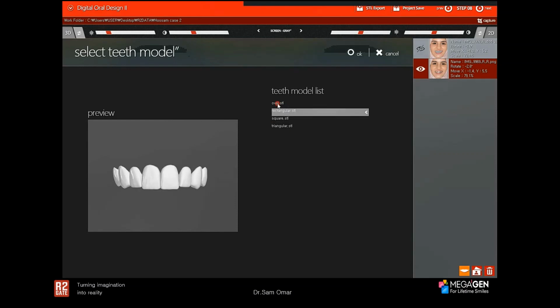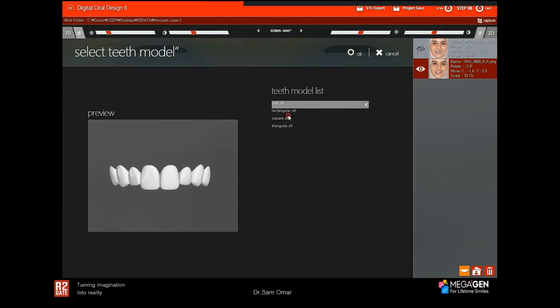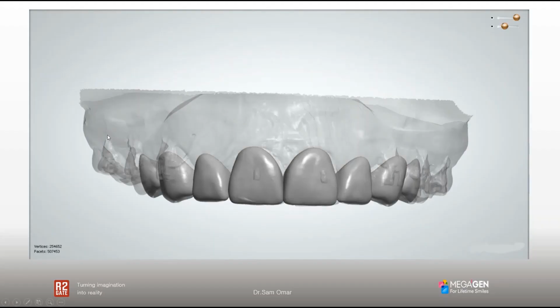And the reason why we do that is because when we do a smile design that will eventually allow us to design the prosthesis, we would like the prosthesis to look good on the patient's face. So we started out with the oval design, and then we started out with a rectangular design. And what we found was maybe the triangular design would be the best looking design on the patient. So based on this information, we're able to extract this information, and we're able to design the temporary restoration to look exactly like what we have in the smile design.